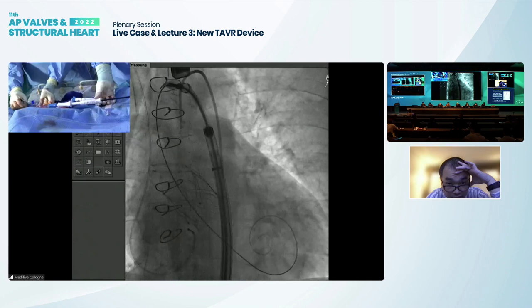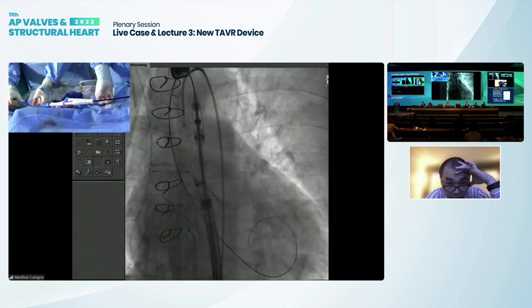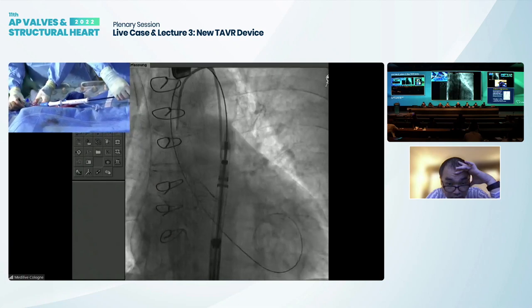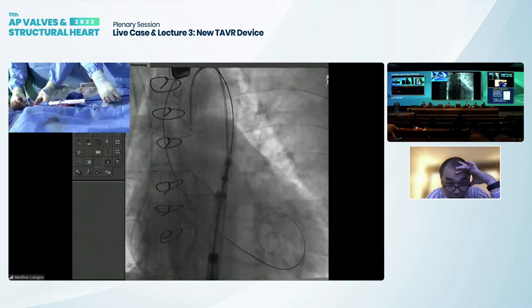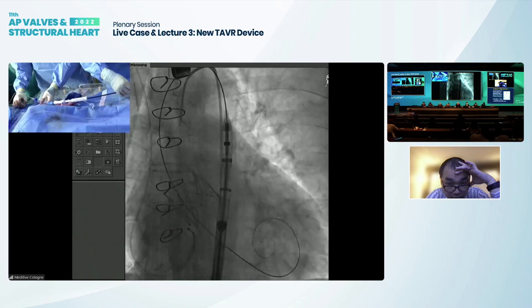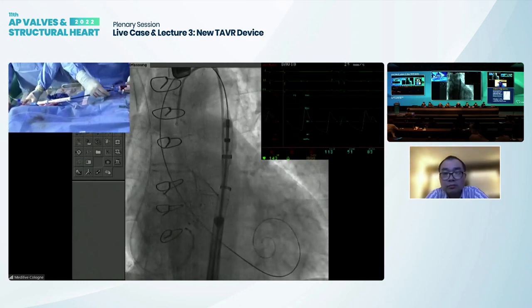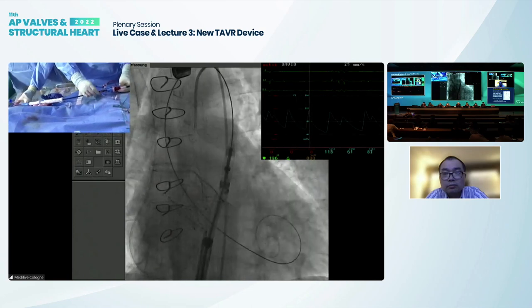And to answer the question, because you spoke about fast delivery, we're not routinely doing TOE. Usually 80-90% of our patients are in conscious sedation, right? So we would not do TOE. We certainly appreciate the extra effort.